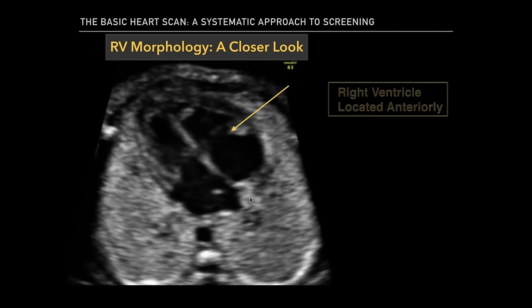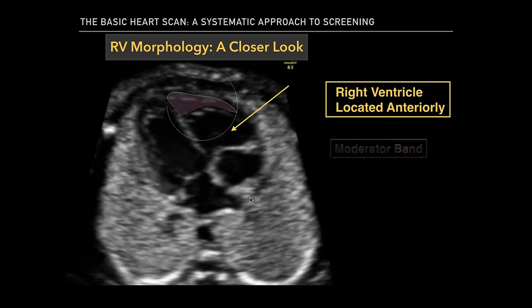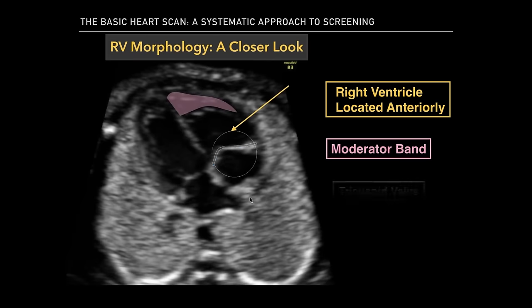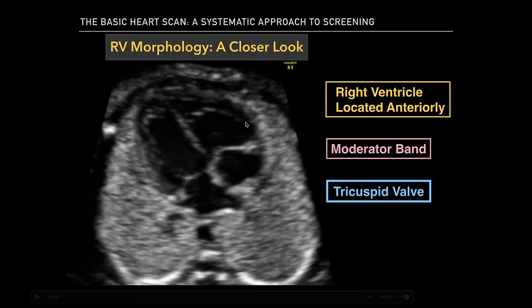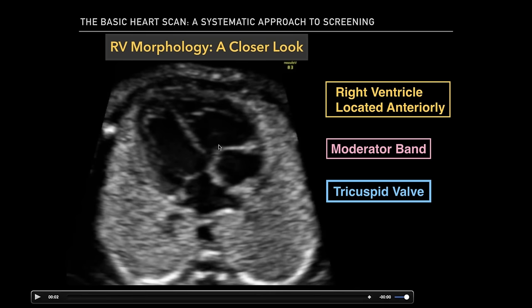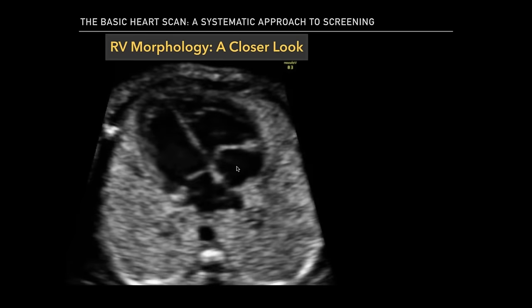So let's take a closer look at the heart, at the morphology, starting with the right ventricle. Here we have the right ventricle, which is located toward the anterior chest wall, with the moderator band occupying the apical portion, and the tricuspid valve, which inserts more apically, corresponding to the atrioventricular valve for the right ventricle. So this is characteristic of the right ventricle.